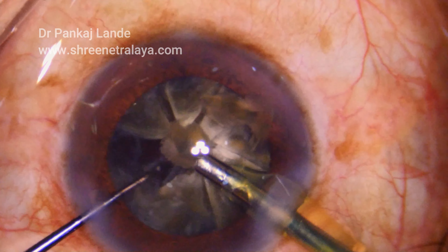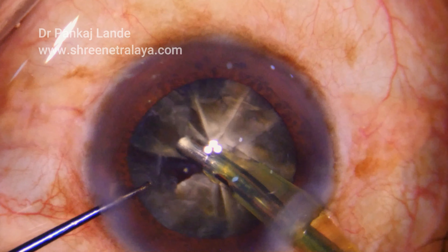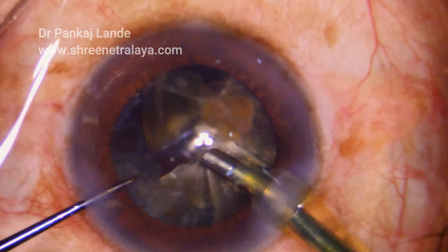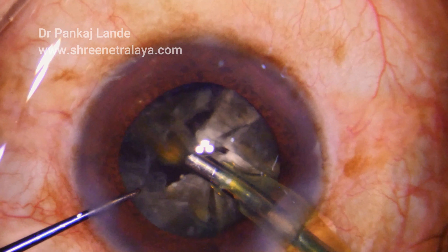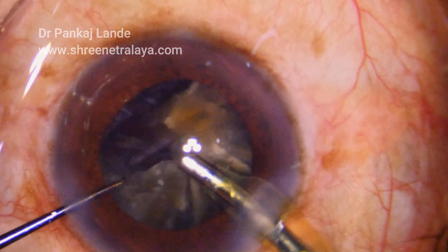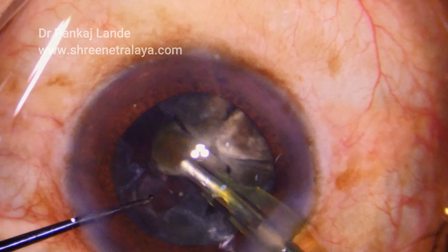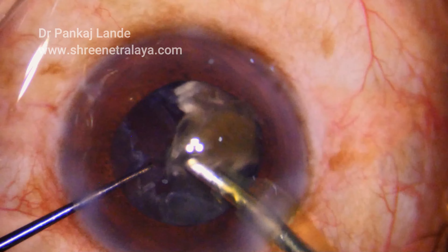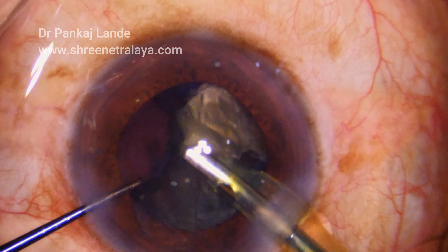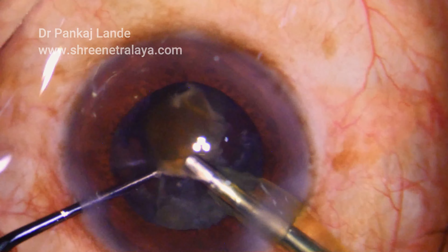As you can see, pre-chopping is one of the best techniques to avoid unnecessary dissipation of ultrasonic energy into the anterior chamber, causing risk to the endothelium. This technique can save a significant loss of endothelial cells in such hard cataracts. Even femtosecond will not cut through completely in such hard nuclei, and you can note how easily the nuclei are taken out with each part separated and the case managed very well.